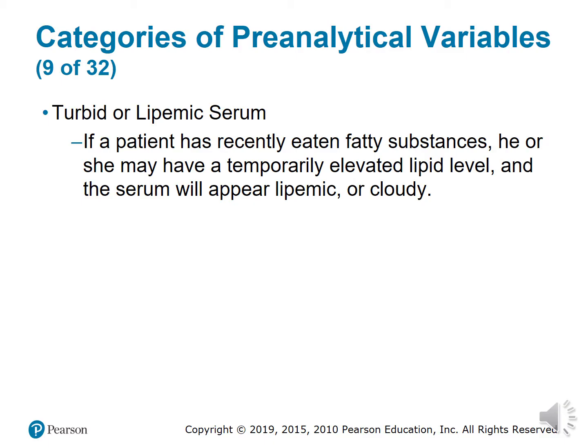Turbid or lipemic serum, sorry. If a patient has eaten a fatty substance, the patient can have serum that is lipemic or cloudy. A specimen that is cloudy shows a sign that the patient may have a temporarily elevated lipid, triglyceride, or cholesterol level.